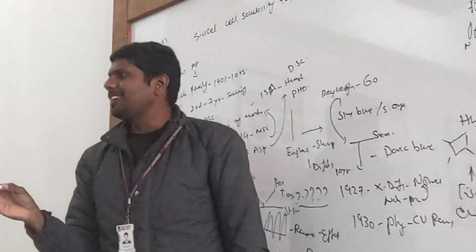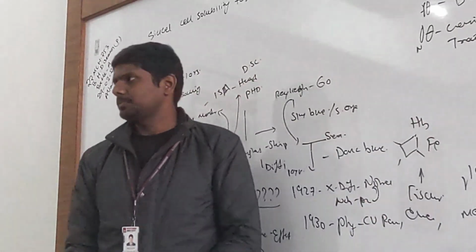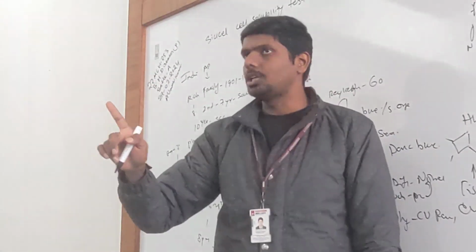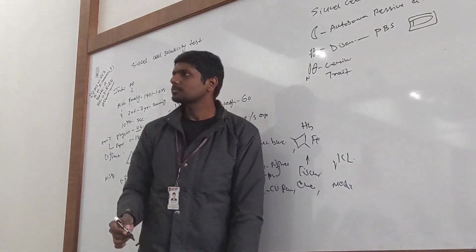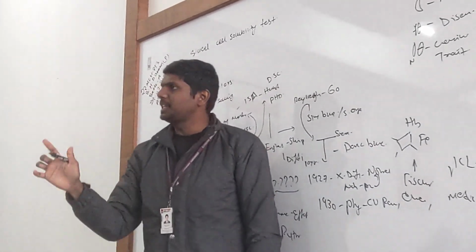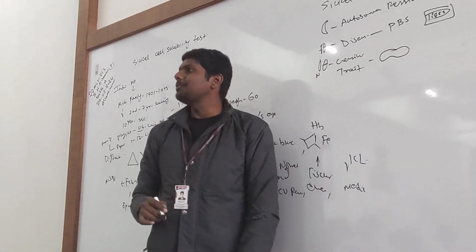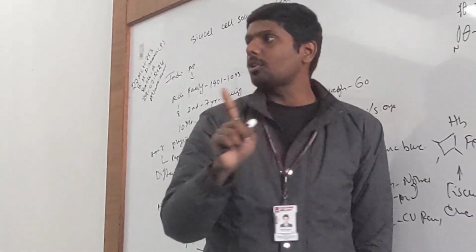The sickle cell carrier condition is also called sickle cell trait. Now listen. Disease we already know. In diseased individuals, when we perform the peripheral blood smear, obviously we will see sickle shape RBCs. Whereas in the sickle trait, their RBC looks normal. In sickle cell trait, the RBC will be in biconcave shape.